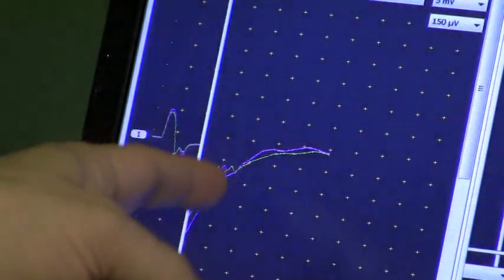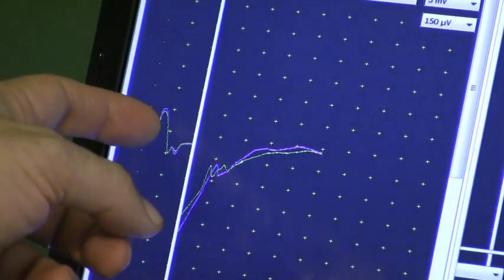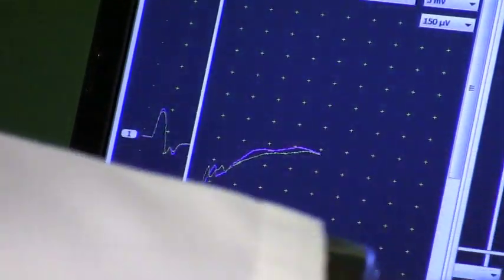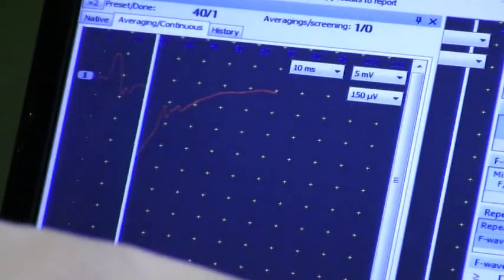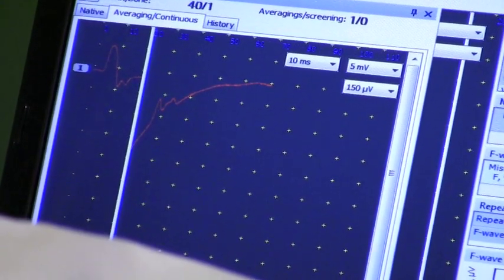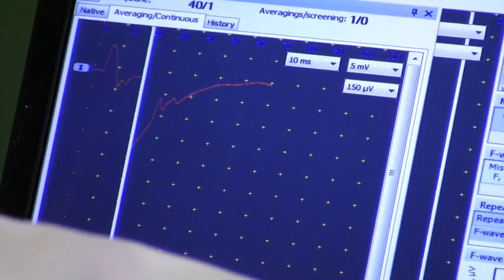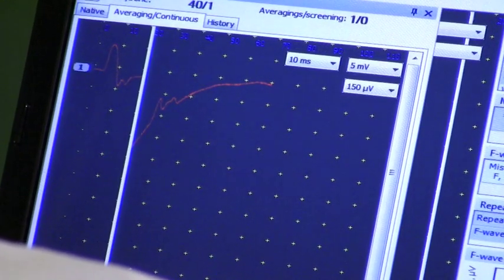So now that we've got some responses, you see here on the right side. We know that the left side is working. We're not looking at the right side. The right side is coming from the neck. So let's do this here. We start stimulating. I'm going to give you about 10 shocks because I'm going to see which one is the best one for me to measure, and the best one is the fastest one, the one that has the shortest latency. See, here we go.